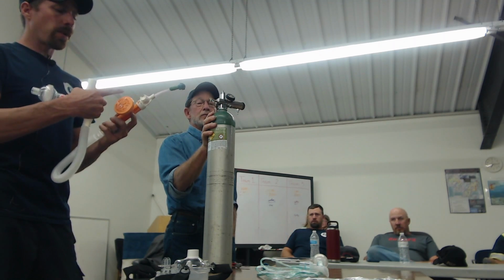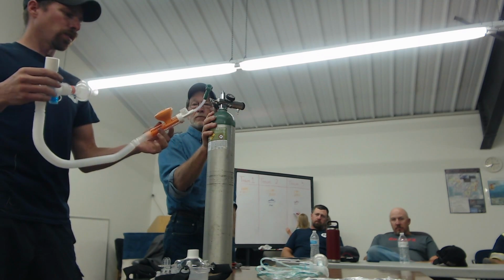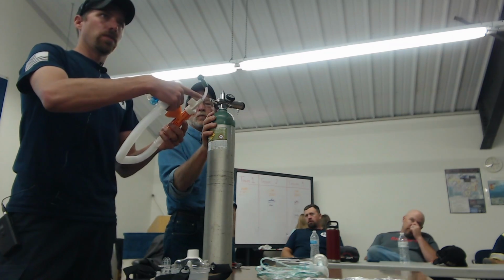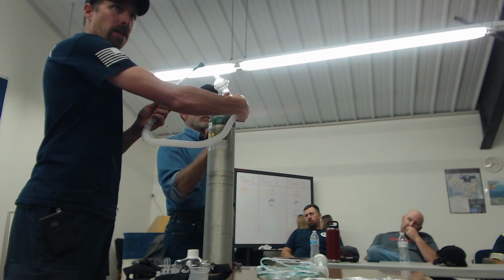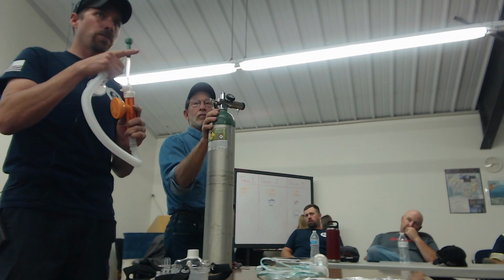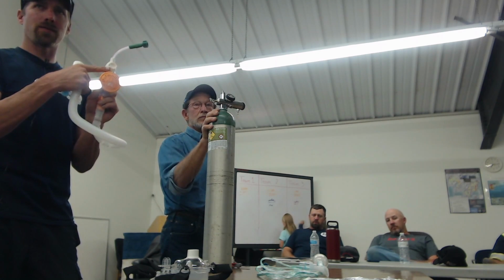So out of the bag, it's coming set at 30 FiO2. So the way this particular system works is you're getting 15 liters per minute of oxygen at pressure. So it's different than 15 liters a minute out of the regulator port. This is 15 liters a minute, but no pressure behind it. This is going to be 15 liters a minute with pressure. It's going to pass through this valve that will regulate it to the 30 FiO2. Speaking of which, does anybody recall what FiO2 stands for? Think on that for a little bit. We'll come back to it.